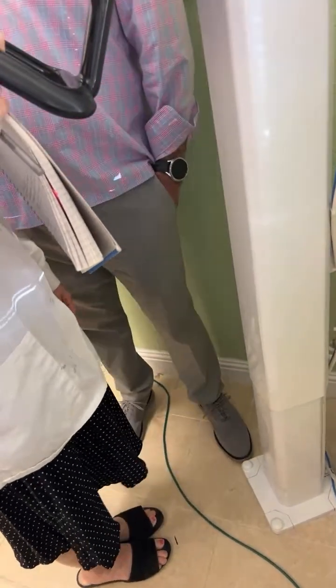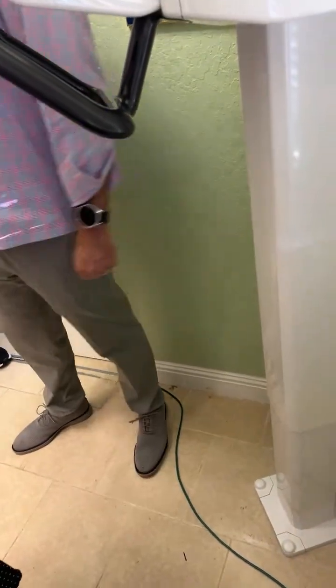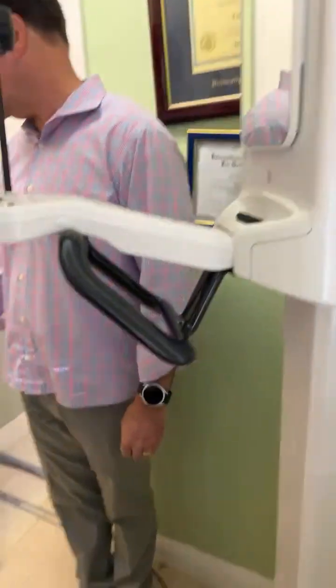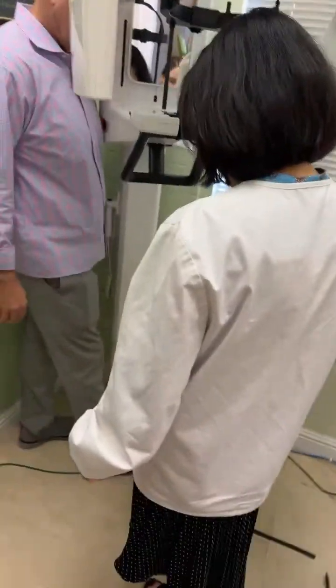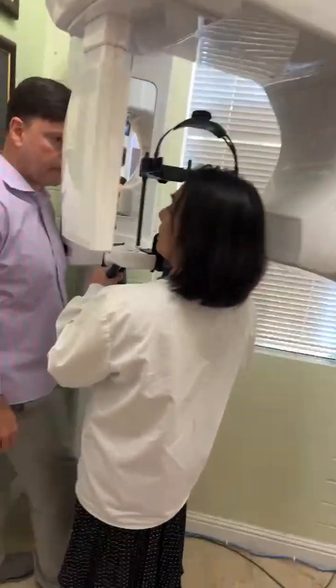Don't tell the patient to look down. You put your foot there. Otherwise, they come in the machine like this. It's your foot, and they walk till they touch it. Okay? So when they step right here and hold the hand, put the chin on, with a little bit of bend in the back.